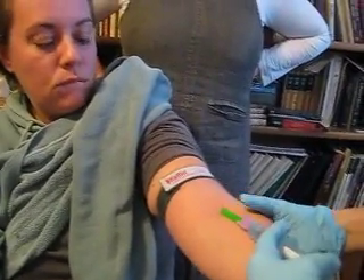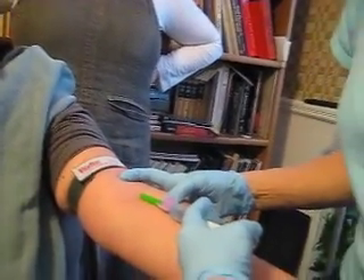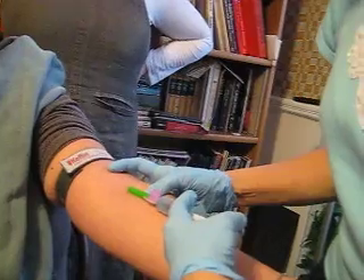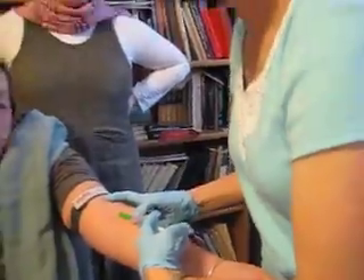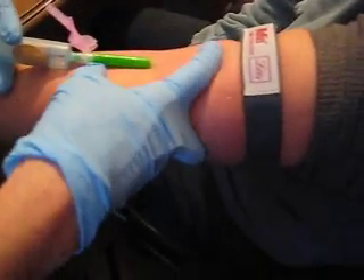Then you want to use your hands and fingers like this, above and below, to make the skin taut — not on the vein, but just right here — so that there's less drag. Because the drag is the issue; it has to be beside the vein, not on it.